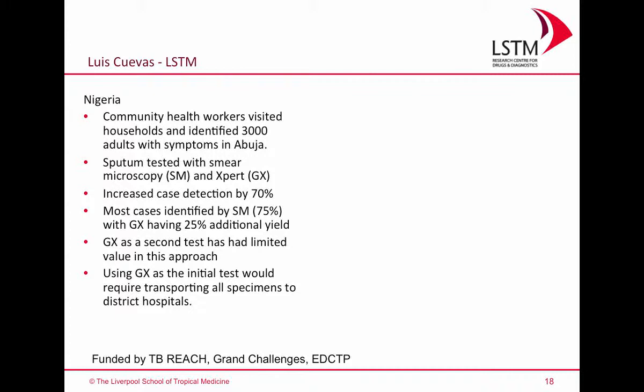They actually concluded that this was of limited value, as you were wasting a lot of expense on the cartridges, etc., and transporting all the samples to where the GeneXpert had been implemented.